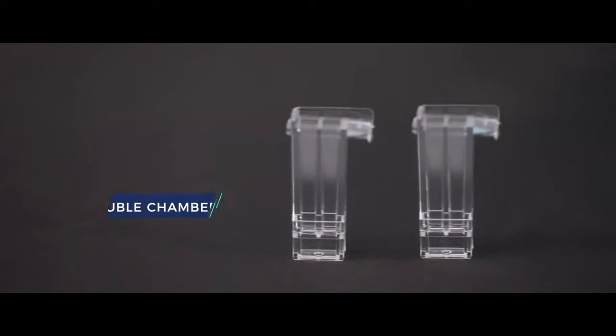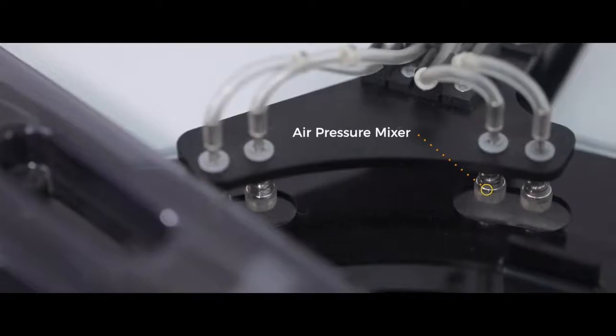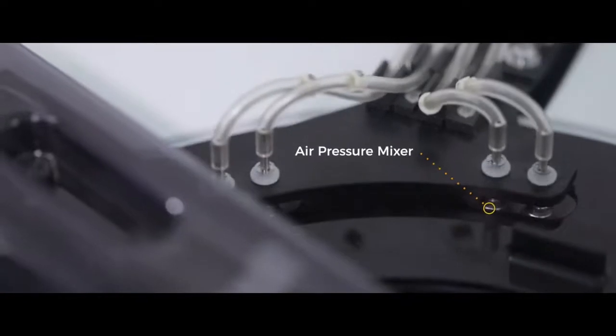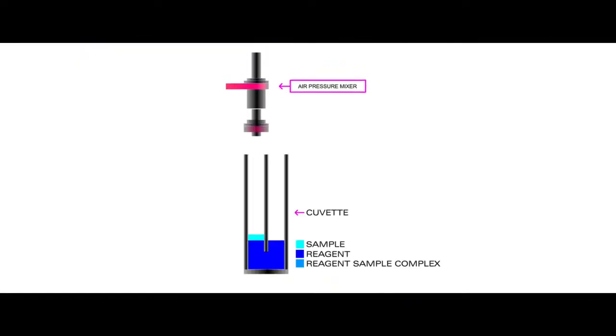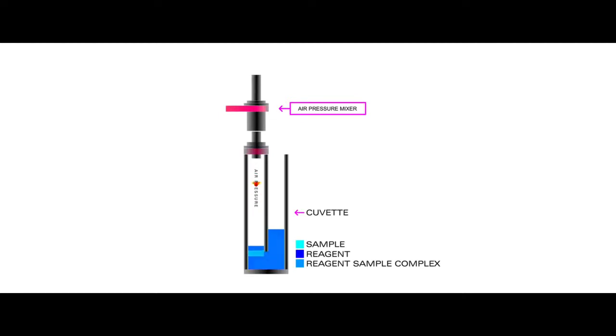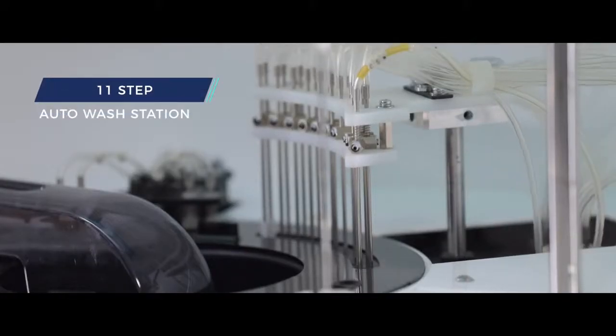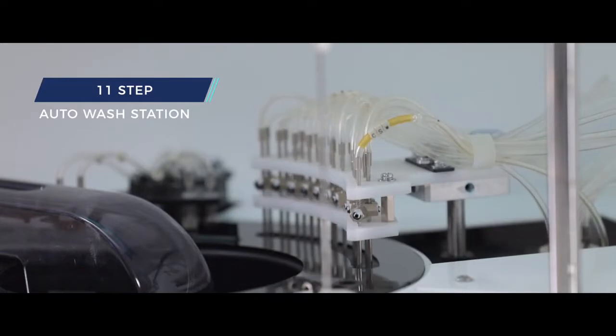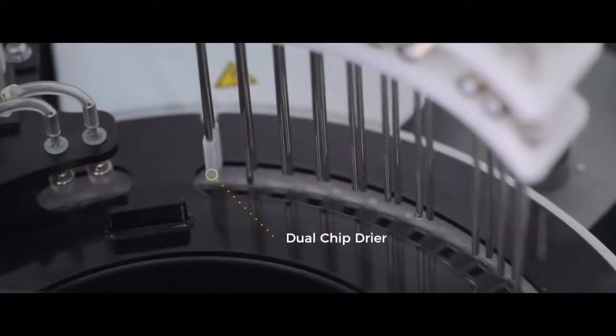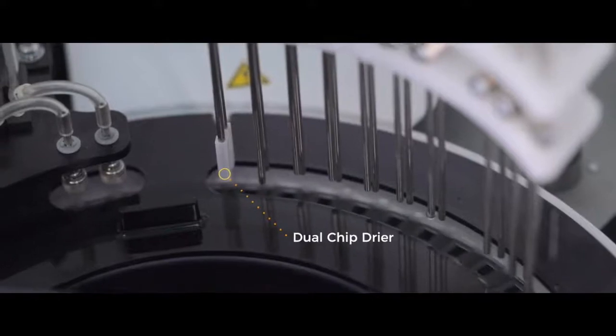TMS-30i uses patented double-chambered cuvette in the reaction tray. The cuvettes are specially designed for air pressure mixing. This type of contactless mixing avoids the chances of contamination and there is no water usage, unlike in other equipment for washing the stirrer-mixer probes. All 60 cuvettes are automatically cleaned by the 11-step wash station with the lowest water consumption in the segment of 3.8 liters per hour.